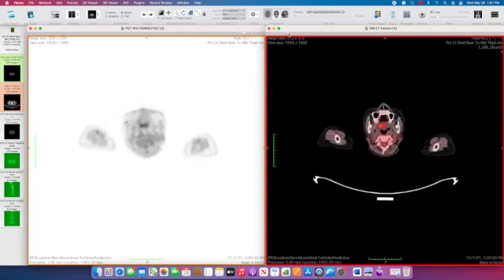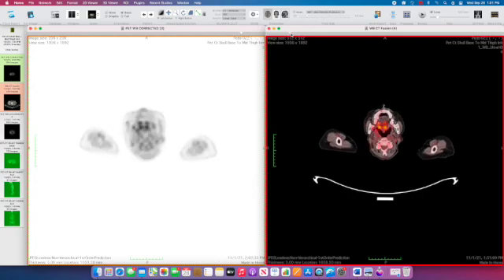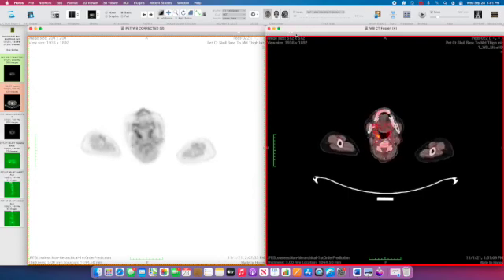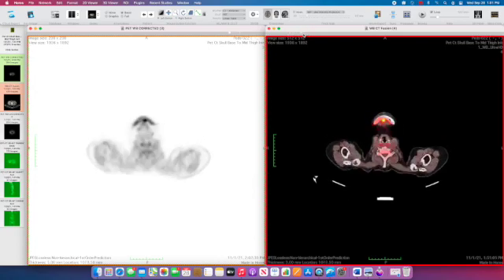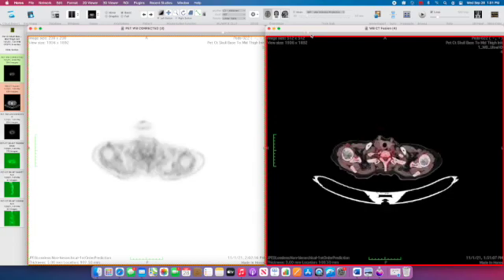So there's physiologic activity in this patient in the brain, in the tonsils, a little bit in the vocal cords.